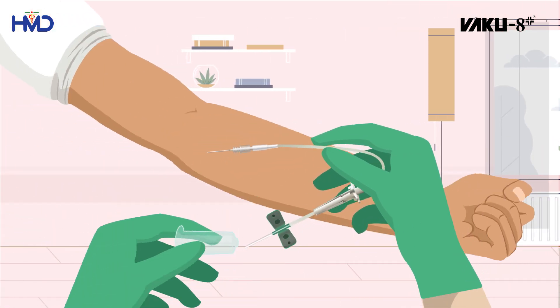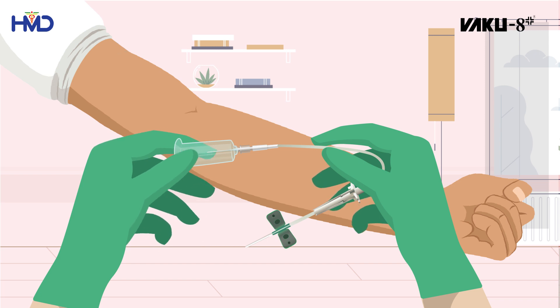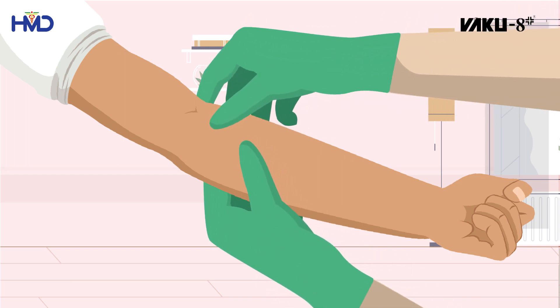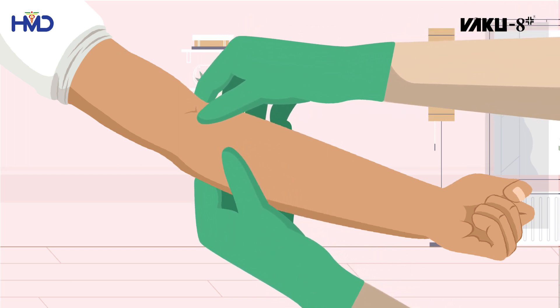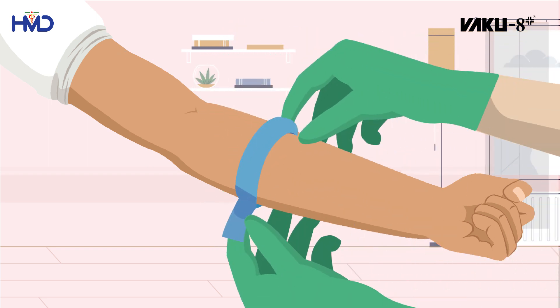To use the VACU 8 Plus Winged Blood Collection Set, screw the tube holder with the Luer adapter. Once assembled, determine the venipuncture site and place the tourniquet above it.